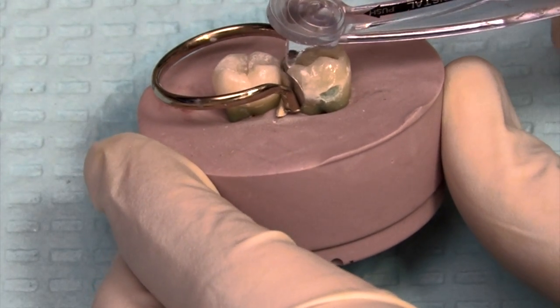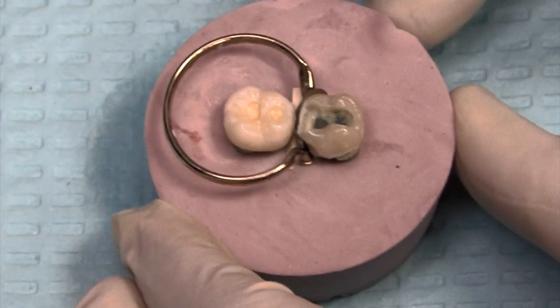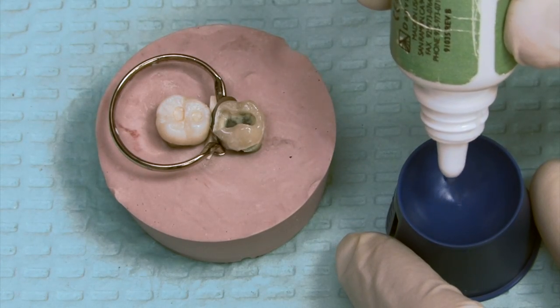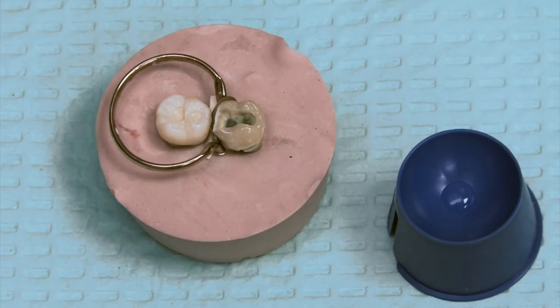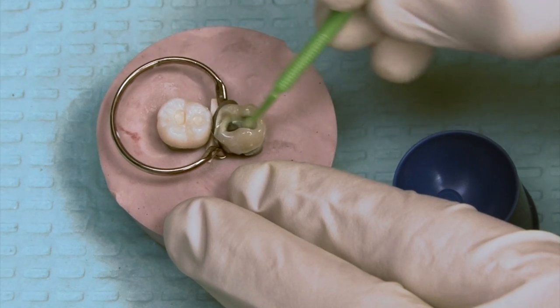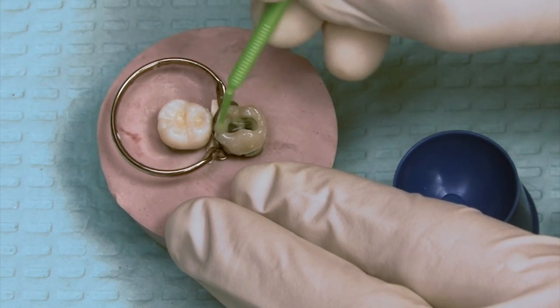The first step when placing a filling is to use MicroPrime by Danville Engineering. It's a glutaraldehyde-based desensitizer as well as a cleaning agent. You'll notice the label on that bottle is green — we use a green brush. We use different colored brushes for different steps so if we're doing multiple fillings the brushes don't get mixed up. We've moved to using dappen dishes instead of dropping the material from the bottle directly onto the brush — it makes it more efficient, cleaner, neater, and less material gets wasted.